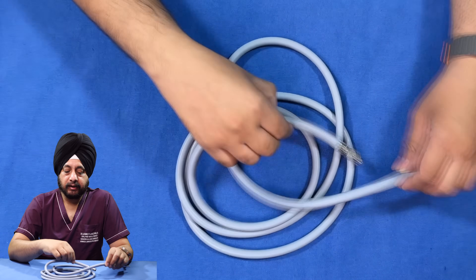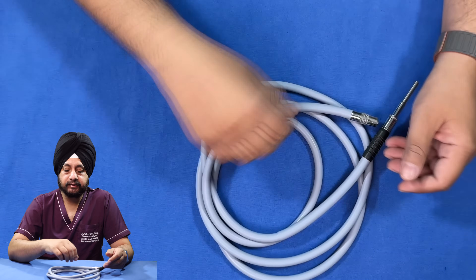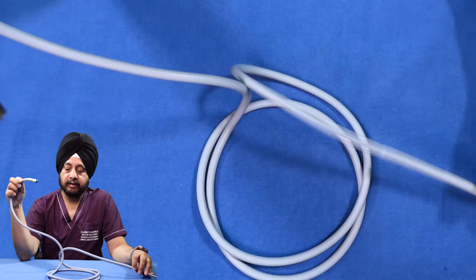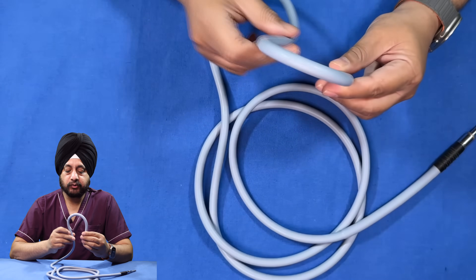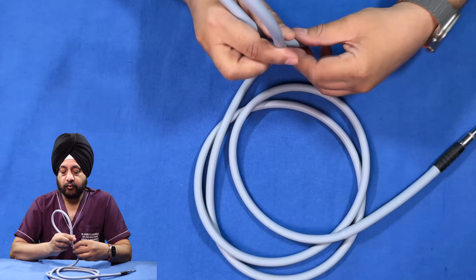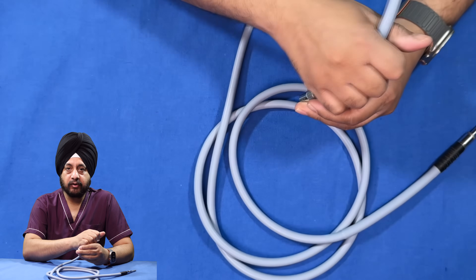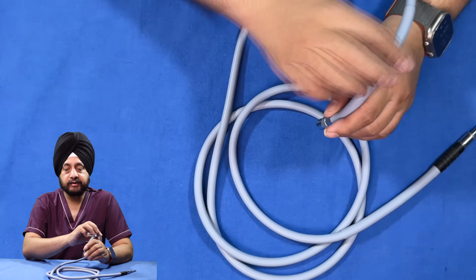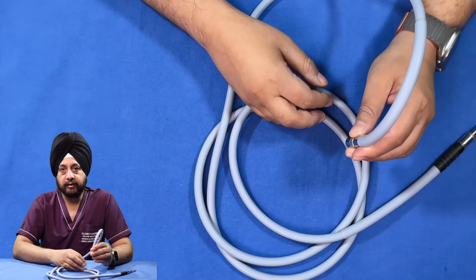The main precaution in storing the light cable is to never make sharp bends — your bend should be very gentle. When using it, especially at the end of the scope, the bend should not be acute; try to hold it with a good angle and avoid giving strain to the cable. You should hold the metallic part and not the fiber optic part, otherwise when bending and twisting, the fibers tend to break.